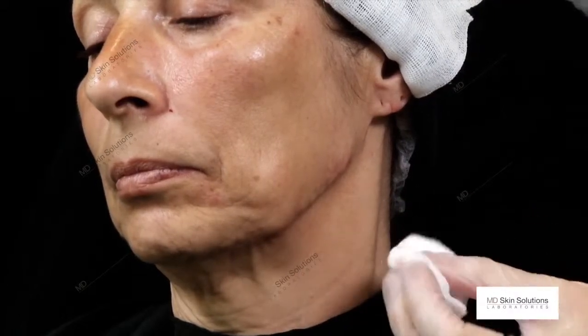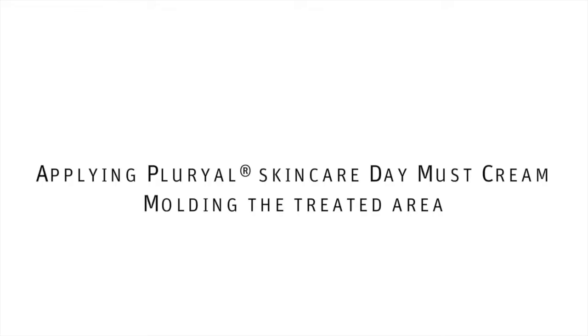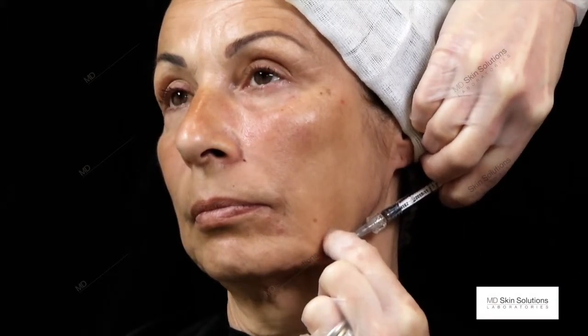What we do now is we mold the filler with the Pluryal Day Cream. Subdermal placement, a little thread here. Pinch eventually in order to hold the filler in between your fingers, and then we're done.